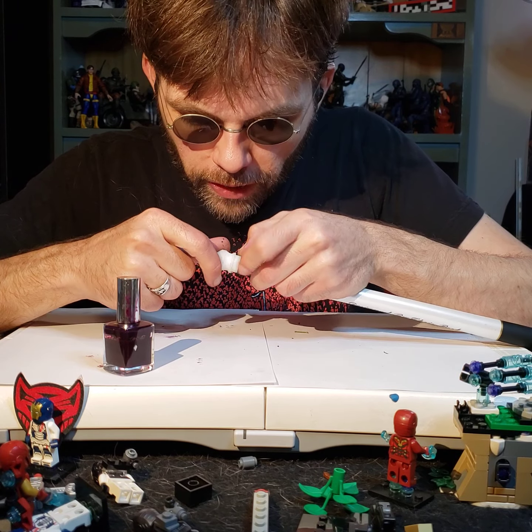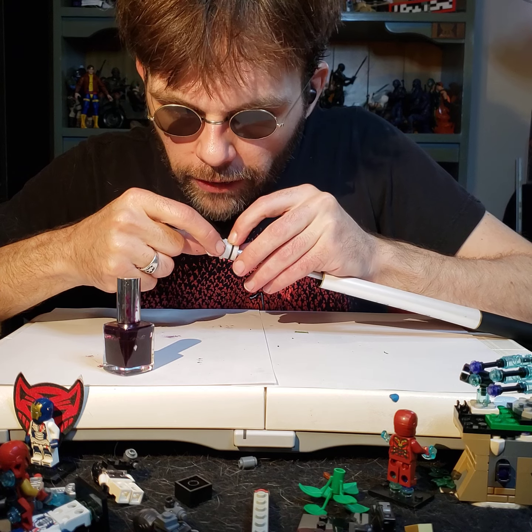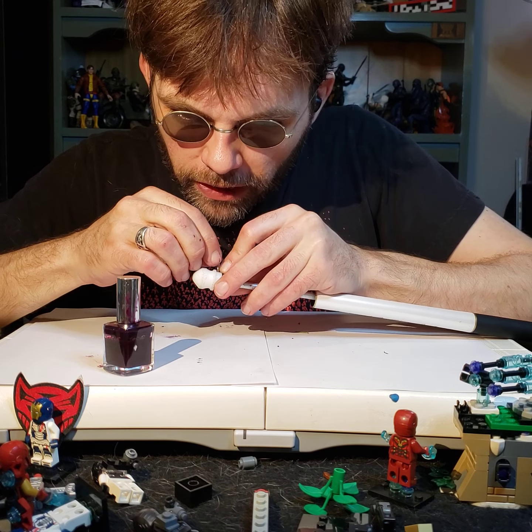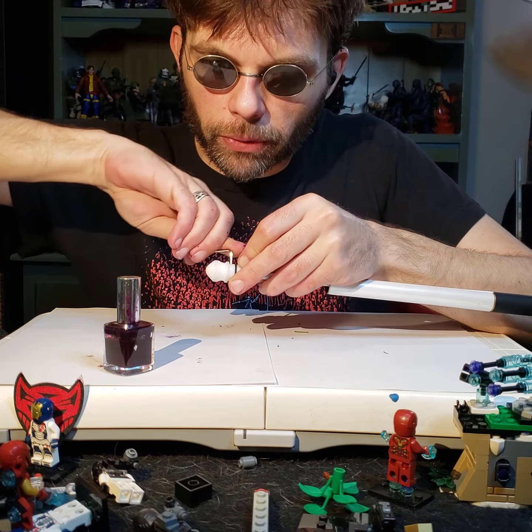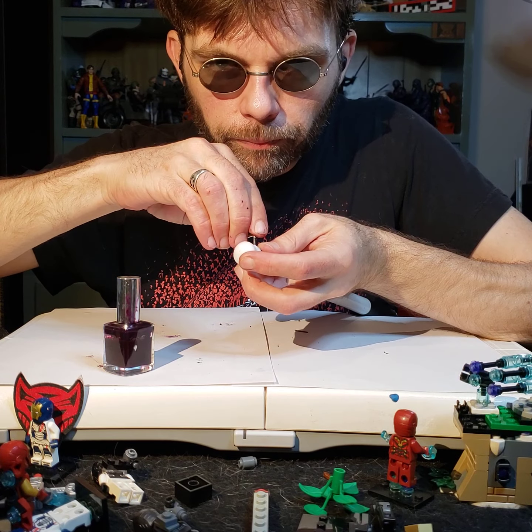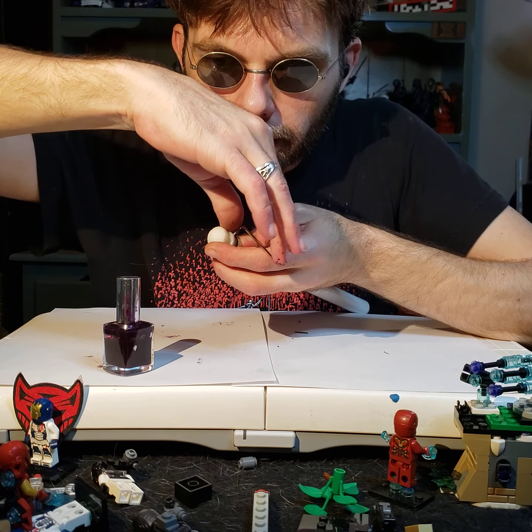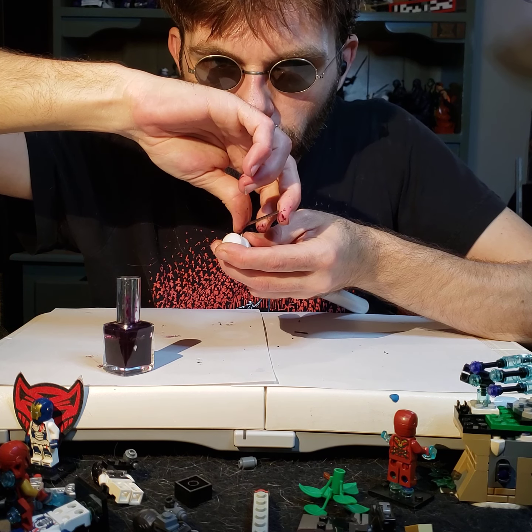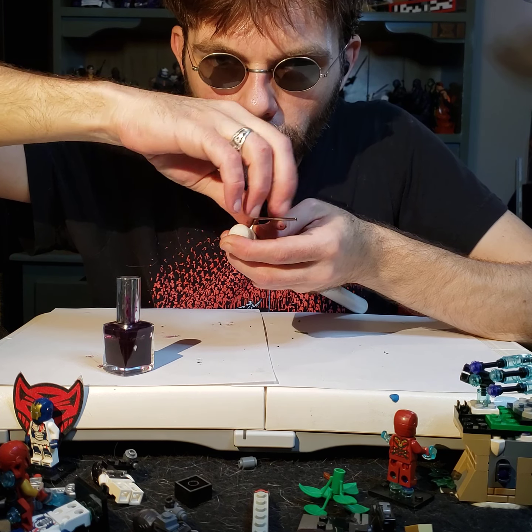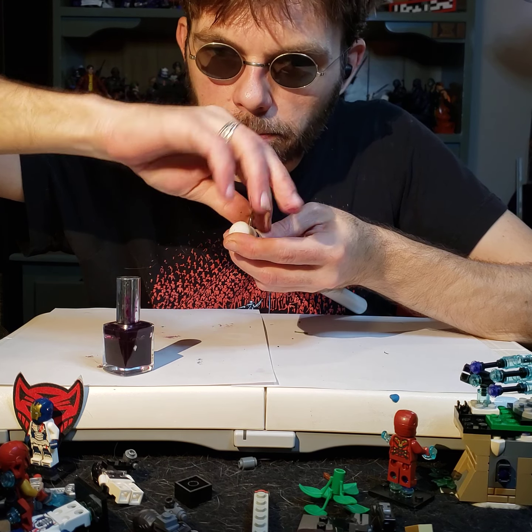Okay, let's spin this around over here and find our hole. Where's our hole? There it is. Aha, the fingertips found it. Okay, let's add the Allen wrench, and remember, righty-tighty, lefty-loosey. So we're going to spin it to the right, and to the right for a second time, and then just a little more. Okay, because we don't want it too tight. We want to be able to untwist it if we need to. So give it that bit more tightness.